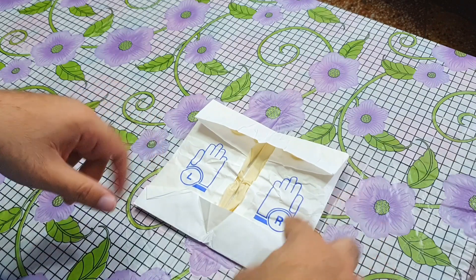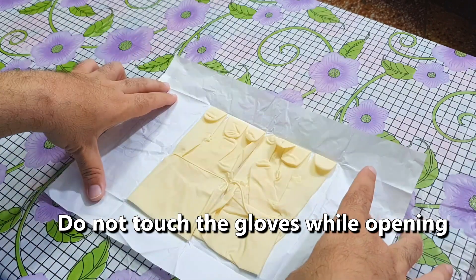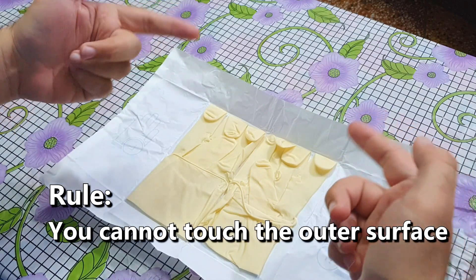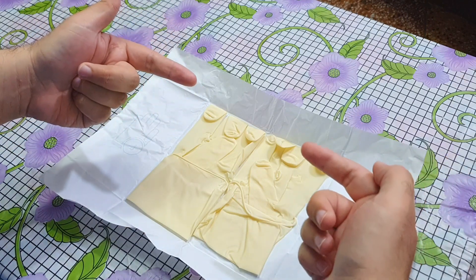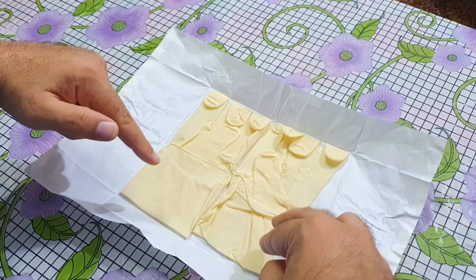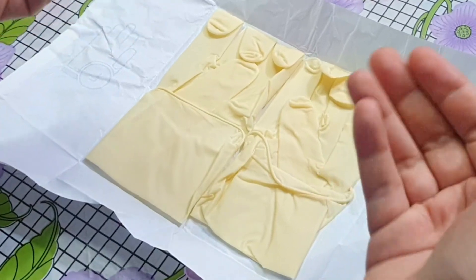Right and left sides are indicated on the packet. Open it, taking care not to touch the gloves while opening. The rule to wear the gloves is simple: you cannot touch the outer surface, but you can touch the inner surface. We have to keep the outer surface sterilized. You can see the inner surface is folded back on itself so that we can pick it up without touching the outer surface.